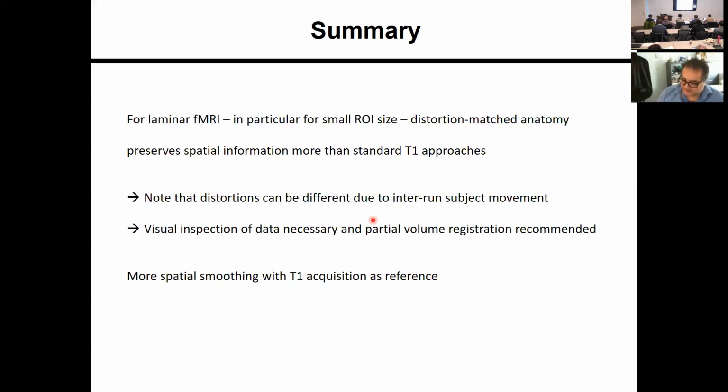So what I would do is, there are different approaches with different software, but emphasize around the region of interest that the registration should be optimized around that part, so that the cost functions are minimized in that part. If there's misregistration somewhere else, you essentially do not care because you want to have the registration in the region of interest. You have to obviously select a slightly larger patch of cortex because you have to have some spatial information. So not just select the region of interest, but a larger patch. But it should still be partial volume registration.